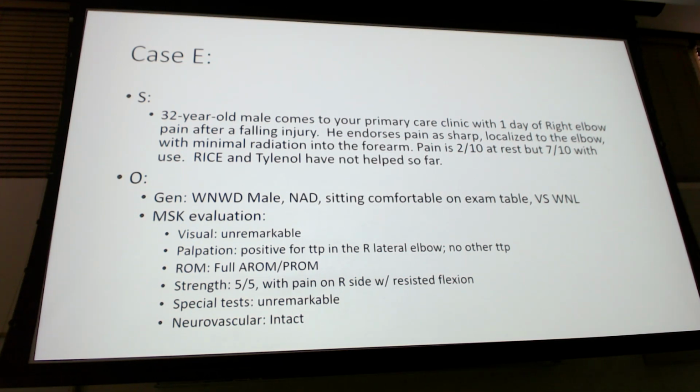Thank you. I had a good question on the break too, now that we're talking about it. We didn't really get into the weeds of I showed you this is your frontal view, your AP view, this is your lateral view, right? But I'm not going to be asking you what view you would see this on. That's not anything you guys really need to know. Your radiology department is going to have standard operating procedures. What I encourage you is when you get to your clinic, ask that question. Hey, if I order a knee x-ray, what does it come with? Do they just do weight bearing by the nature of it, or do I have to order that special? So you don't need to know whether I'm going to order an AP versus a lateral. That's just going to be standard stuff.